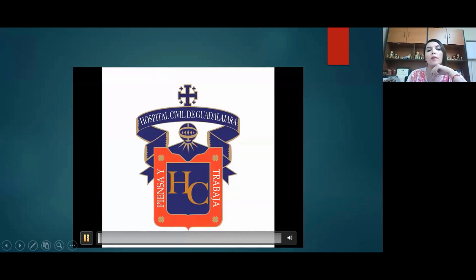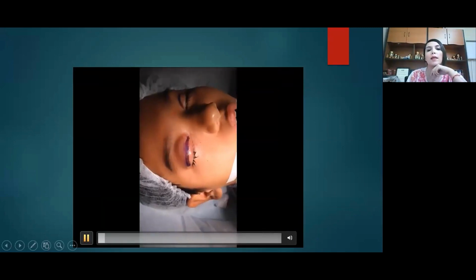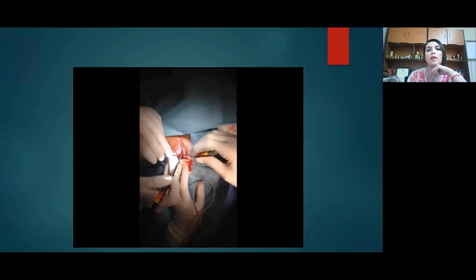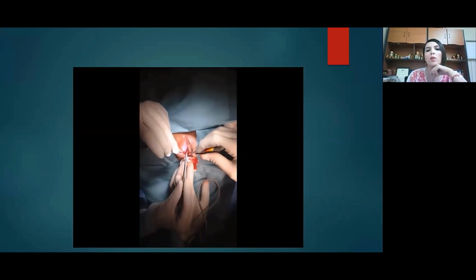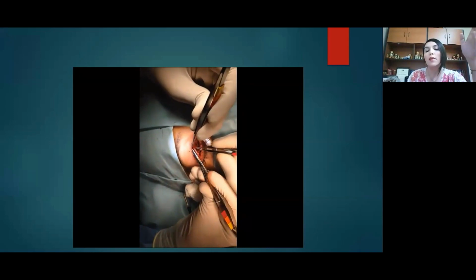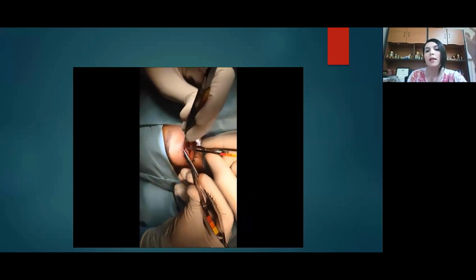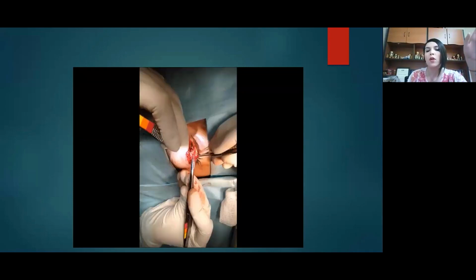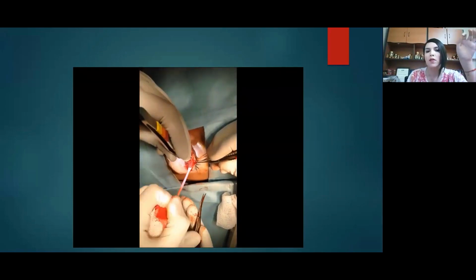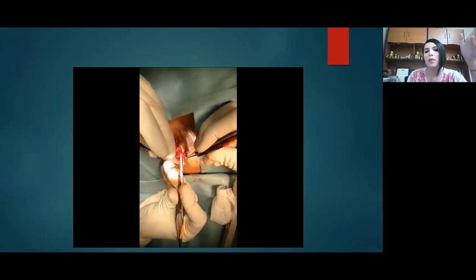So we have the approach by the eyelid sulcus. We mark it in the natural sulcus. We separate the tissues very carefully, because remember that it's a vascular lesion. But with all the studies that we asked for before, we can see where the principal vessel is, to avoid the bleeding.